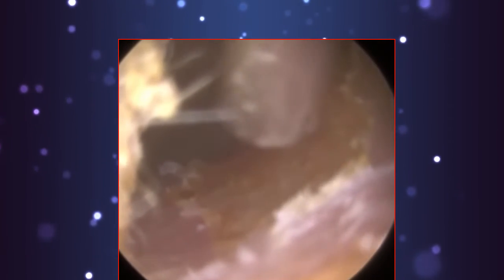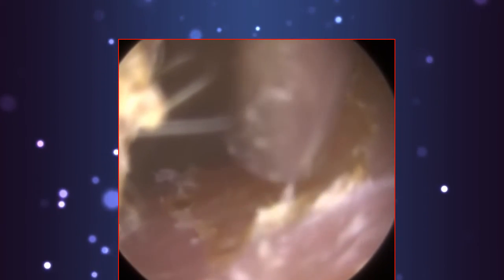So you can see there's a bit of skin here, at the base of the ear canal, and I'm using a fine end gauge. There's been a bit of controversy, I think, with my terminology. Apologies, guys. I'm using a fine tip sucker. I'll just call it that from now on, I think, if I can remember.